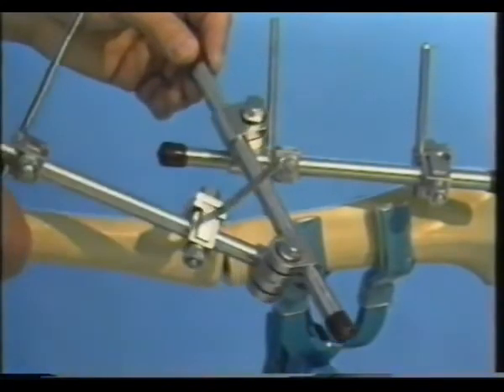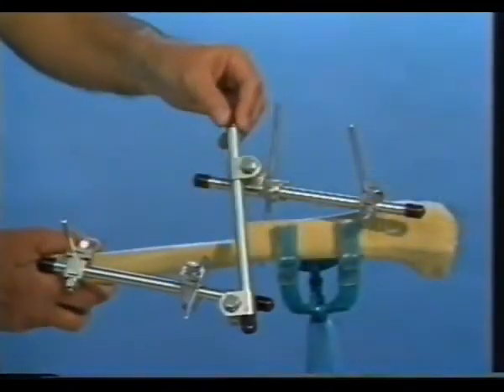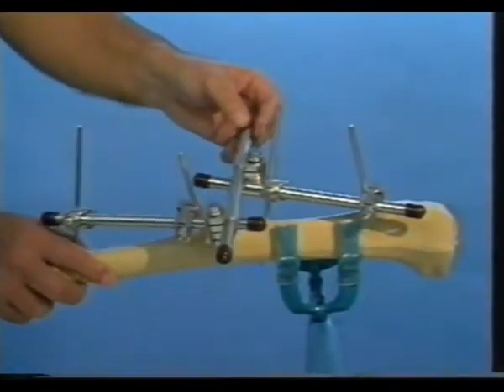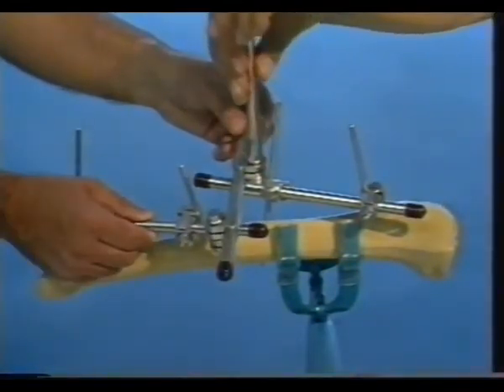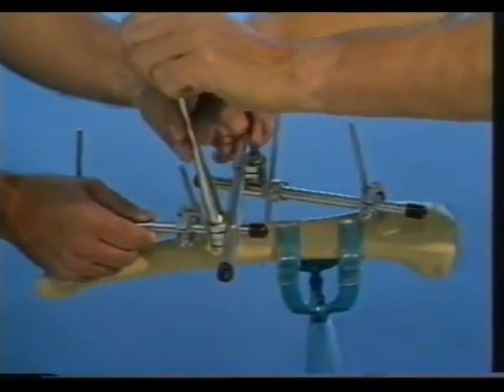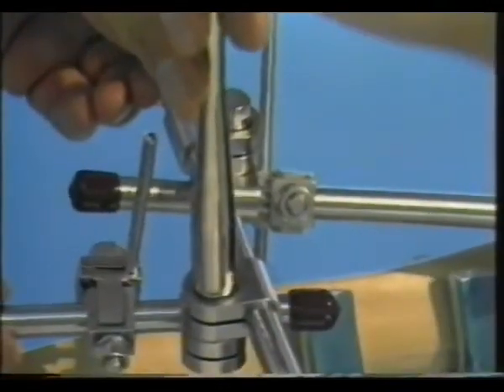Corrections are made by the operator holding the two tubes while the assistant holds the interconnecting tube. After correct reduction of the fracture or osteotomy, the assistant tightens the screw of each tube-to-tube clamp. A second tube is then fixed to complete the construct.